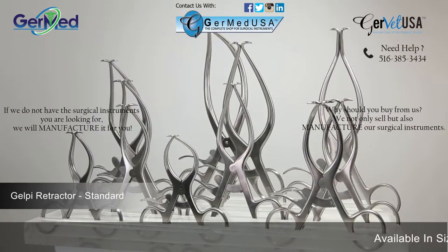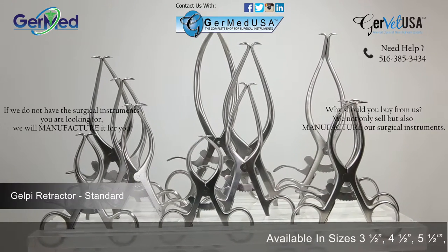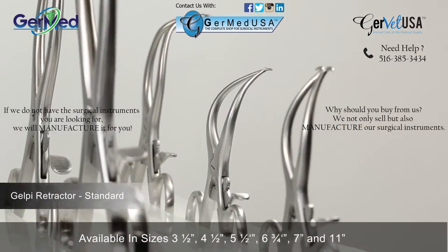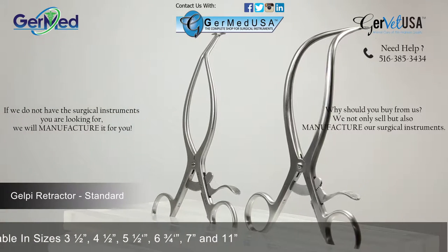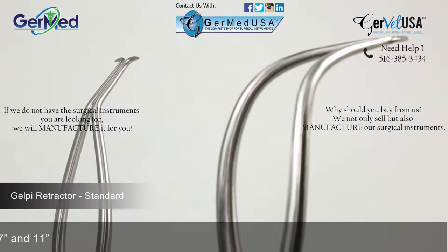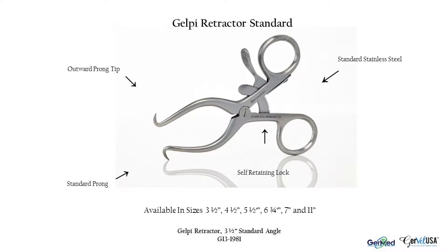GermEd provides Gelpy retractors in a variety of lengths and angles in order to correlate with the size of the patient as well as the type of procedure they are undergoing. They are a ratcheted finger ring instrument used to hold back underlying organs and tissue to access the body part under incision. Gelpy retractors are commonly used for knee joint surgeries. They are made available in sizes 3 1/2, 4 1/2, 5 1/2, 6 3/4, 7, and 11 inches.